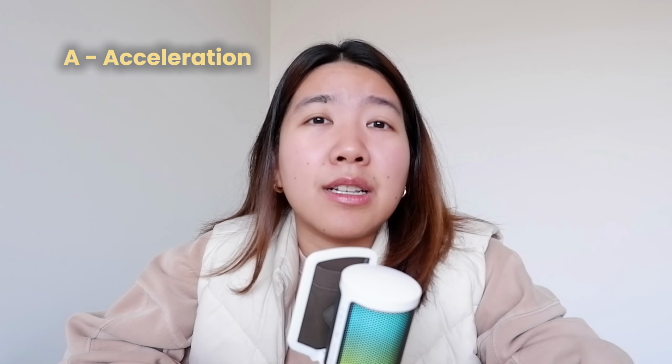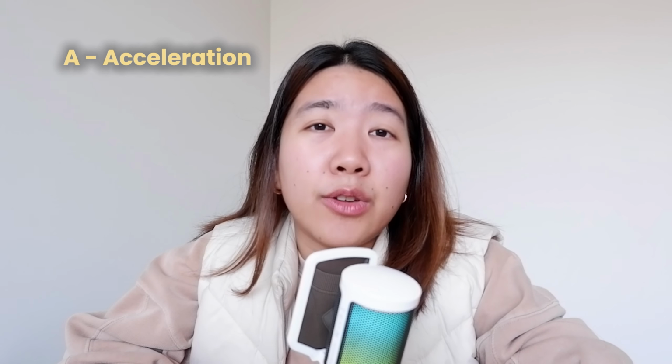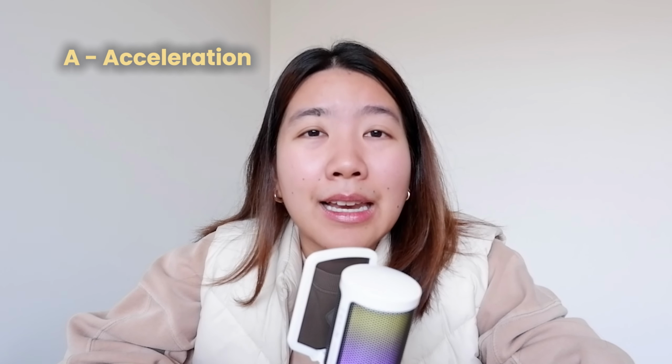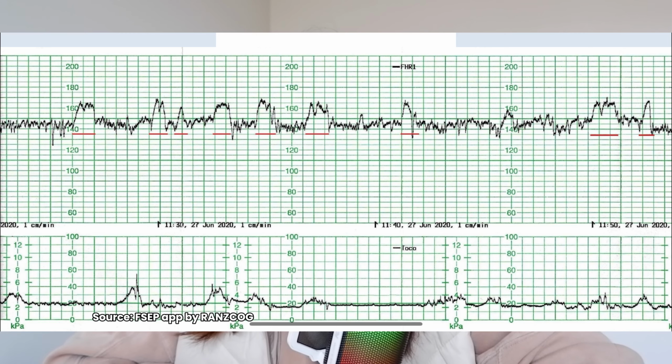Accelerations. Accelerations are transient increases in the fetal heart rate of 15 beats per minute or more and lasting at least 15 seconds. It is a reassuring sign that tells us that the baby is well oxygenated and the nervous system is responding normally. We can say that this CTG is reassuring if we can see 2 or more accelerations in a 20-minute period.